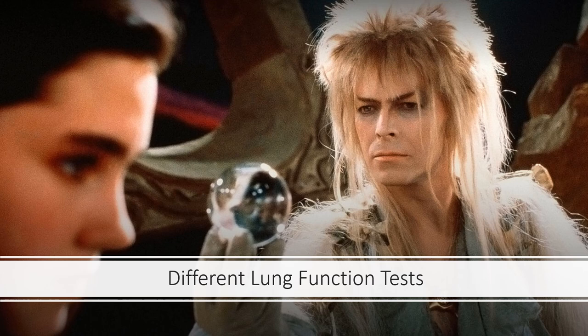Welcome to the third video about pulmonary function testing. So we're going to talk about the different types of lung function tests out there. There's a couple of different types. Like we talked about previously, some will look at how deep you can breathe, others will look at how fast you can breathe, other ones will look at your neural control of breathing, other ones look at diffusion of breathing. So this can get pretty involved.